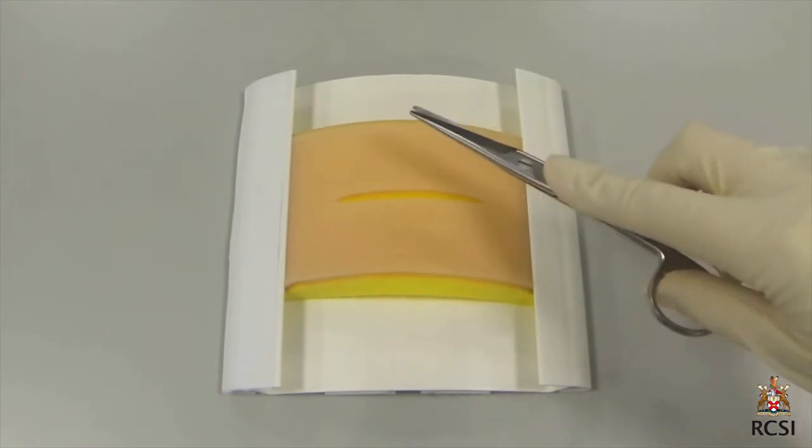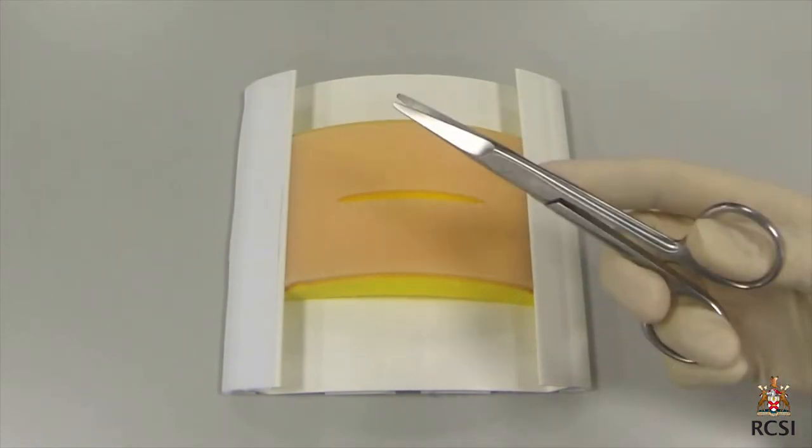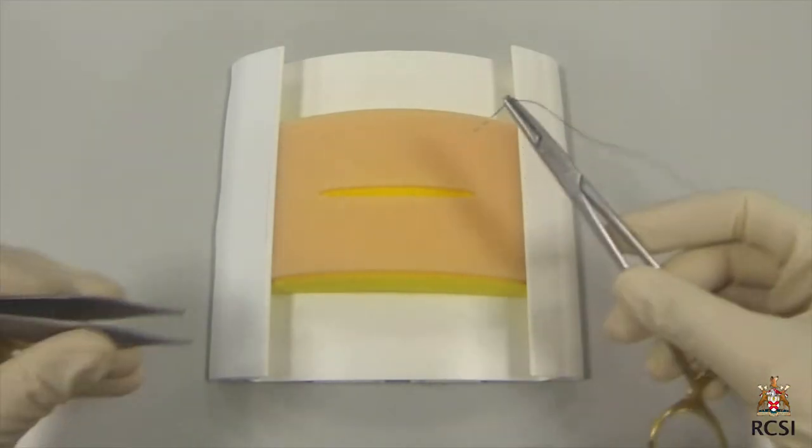The needle holder can also be used by the palming method, which allows greater freedom of rotation of the instrument. The scissor is also held at the tips of the thumb and ring finger and supported by the index finger.